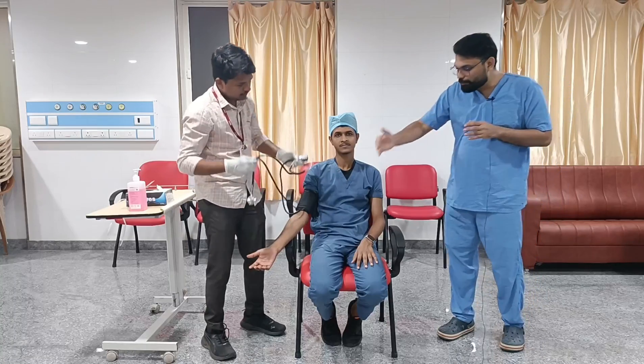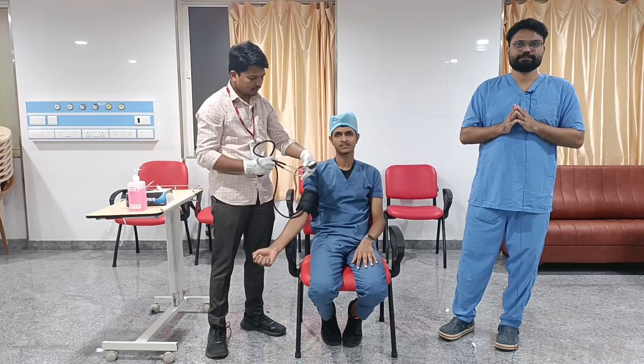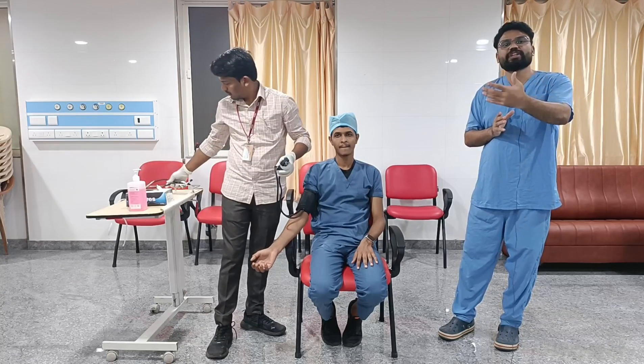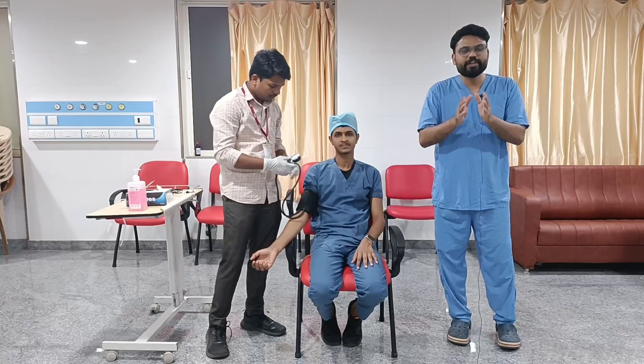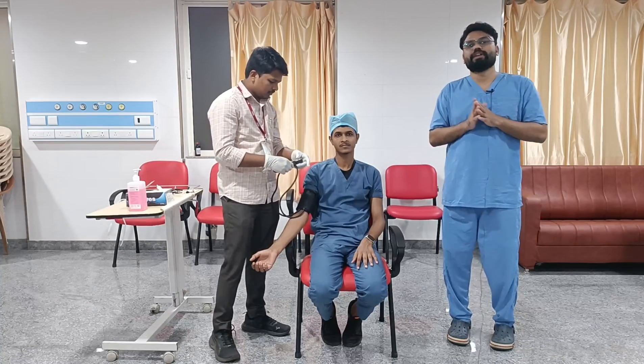Blood pressure should be measured on both arms at the first visit, and the highest reading should be taken. Finally, you need to convey the blood pressure result to the patient both verbally and in writing.